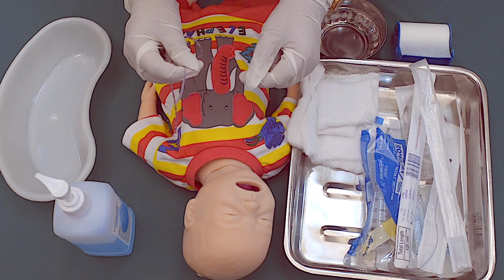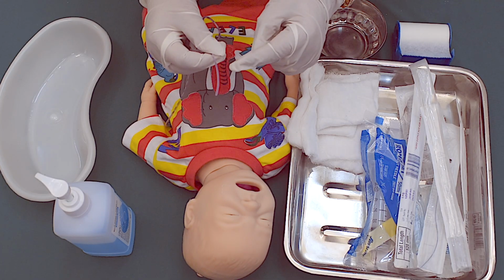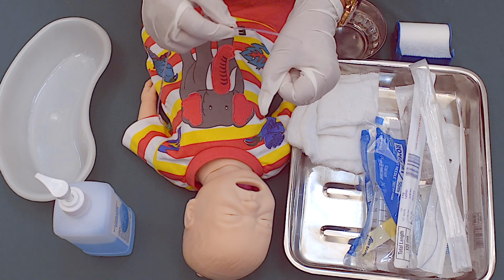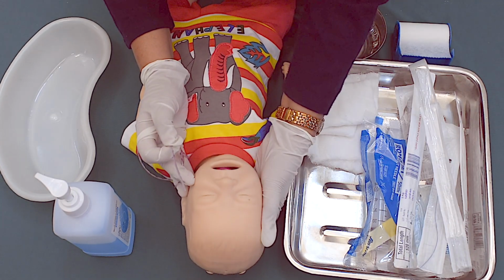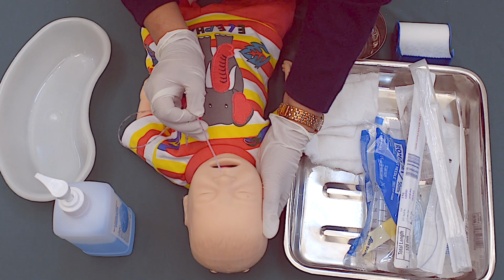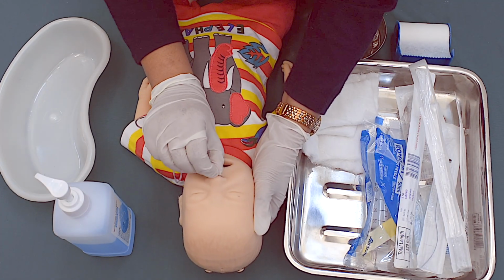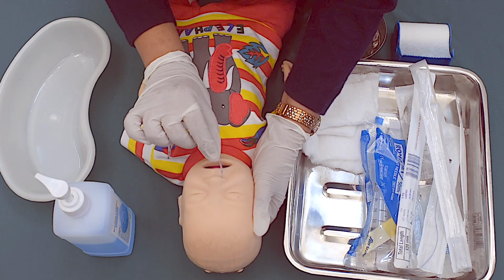Before we start inserting the tube, lubricate the tip of the catheter. It has to be lubricated with the help of a lubricant, a water soluble jelly. Apply the jelly on the tip and flex the head of the baby. Insert the tube from the right nostril and insert the tube up to the marked length. Do not push the tube forcefully.